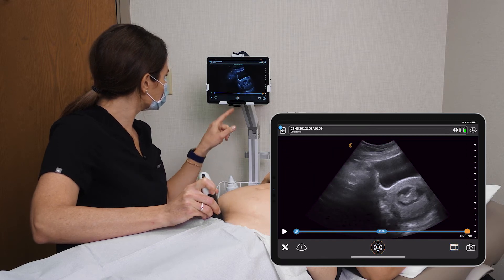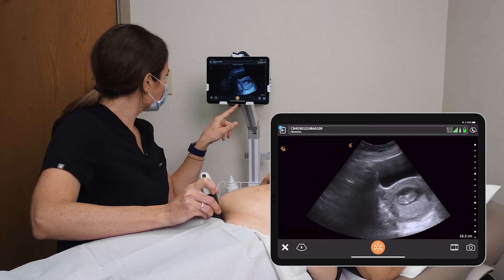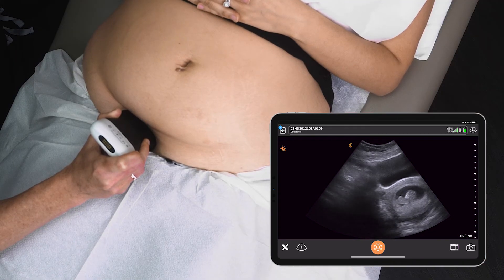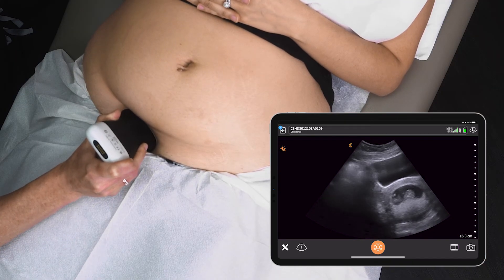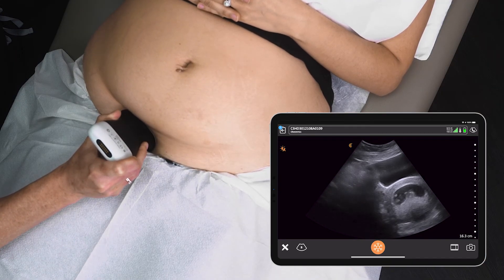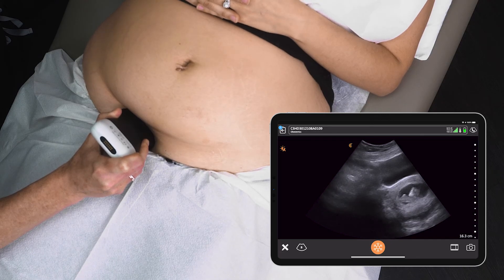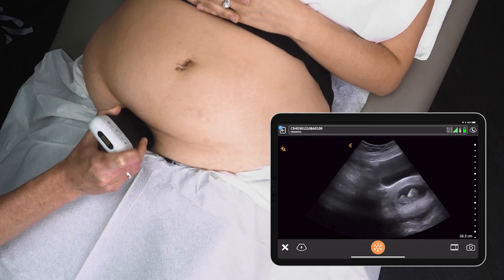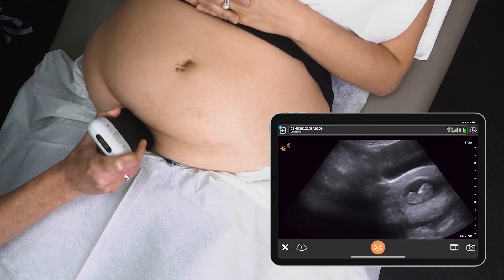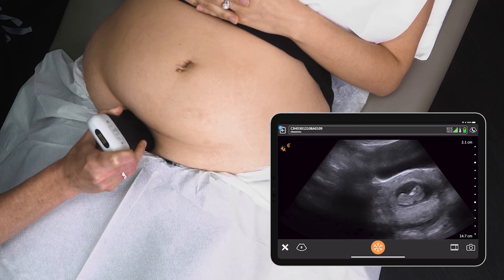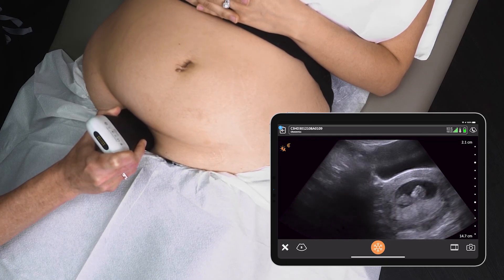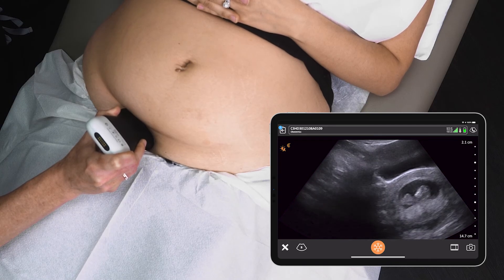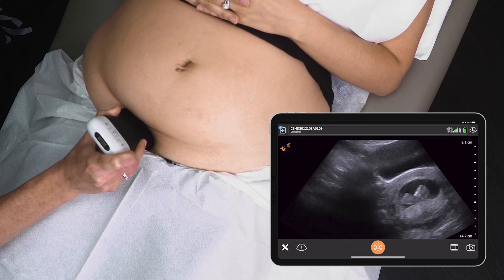Let's see how far along you are — what the gestational age is. I'll try to get the crown rump length. Baby's a little bit curled up right now, so let's see if baby will have a stretch. We can zoom in here — there we go. Let's take a picture.